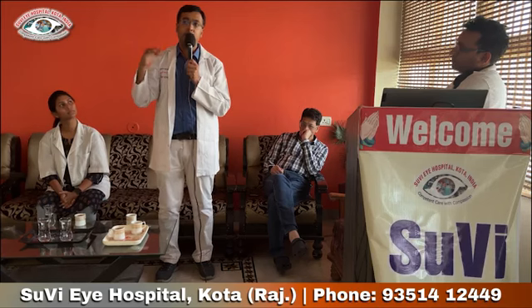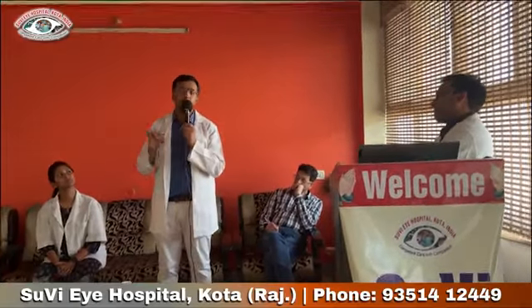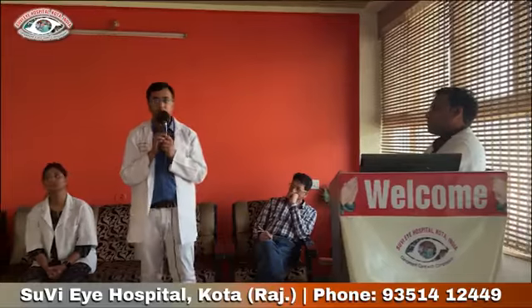We tell the patient strictly to avoid any straining or heavy weight exercise, and we can in fact give a certificate of bed rest up to 15 days in cases of post barrage in view of horseshoe tears. So these are the things for retinal lasers, barrage, cryopexy, and focal lasers.